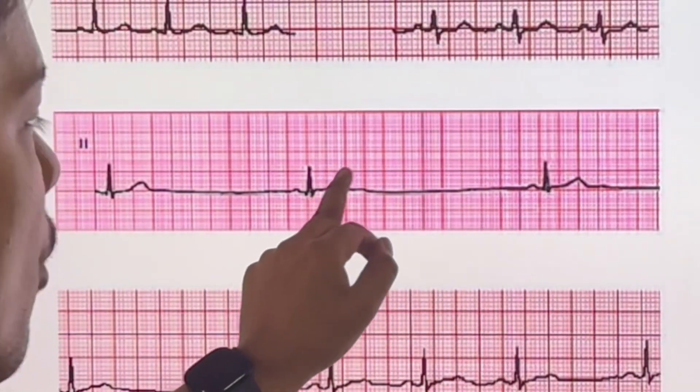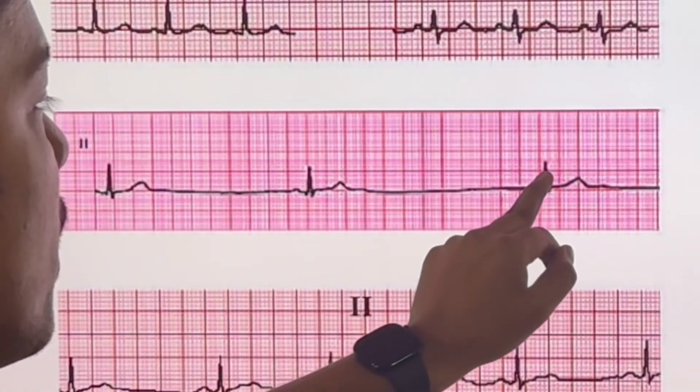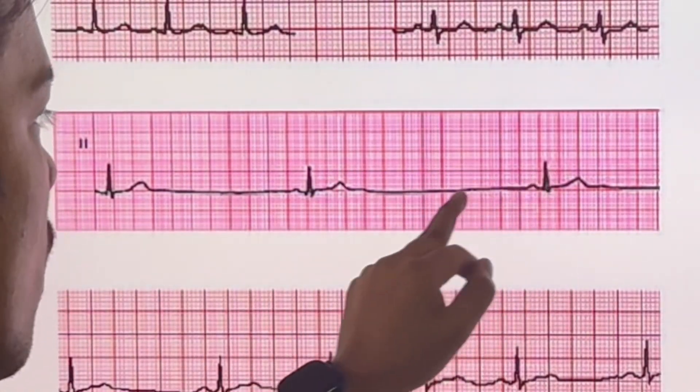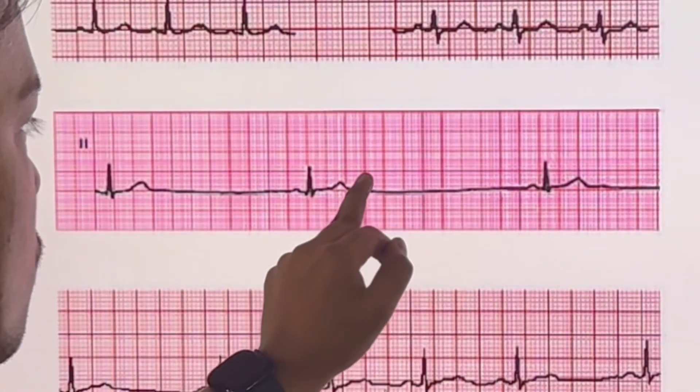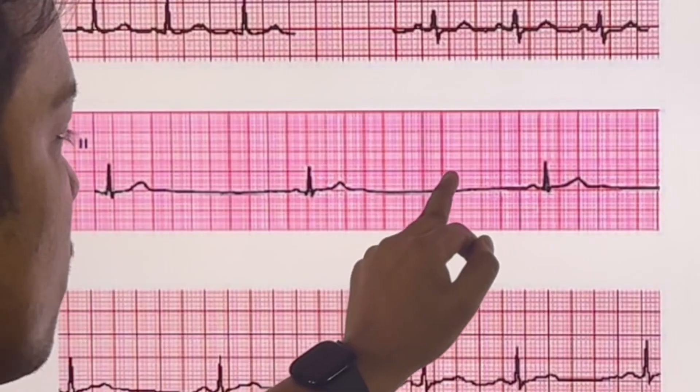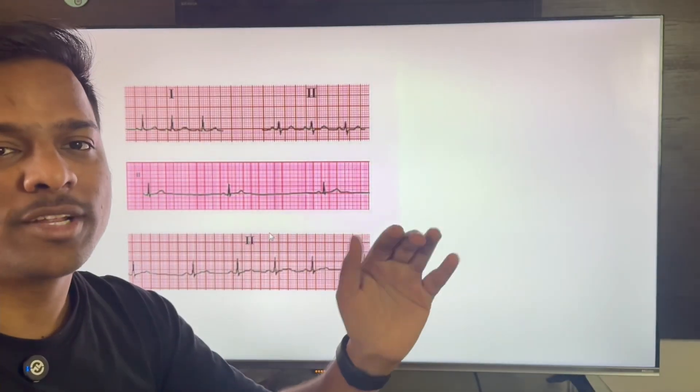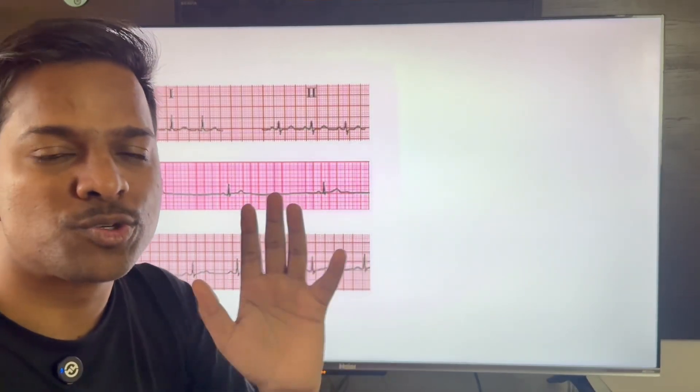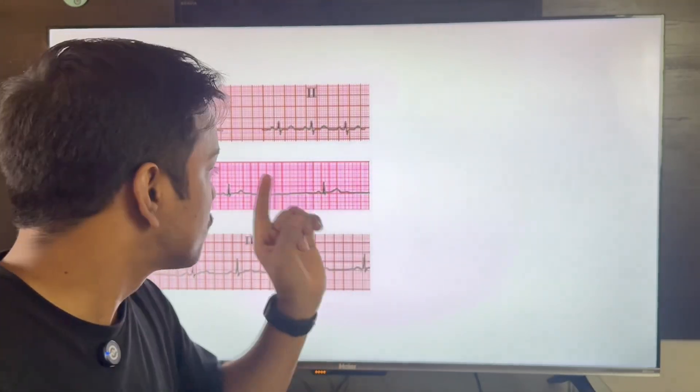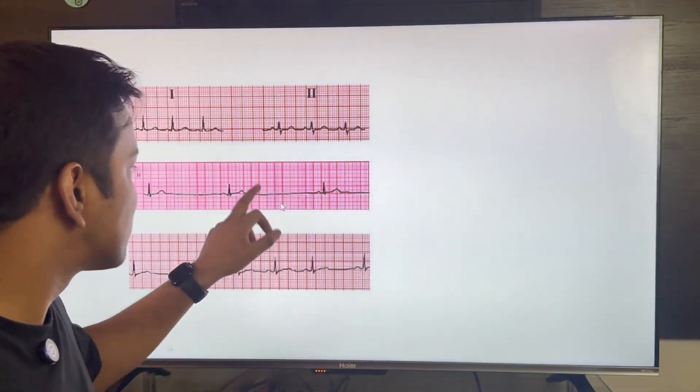In the next ECG, we have P, Q, R, S, and T waves present. The number of big boxes between two RR waves is about ten, so 300 divided by 10 gives a heart rate close to 30. This has to be sinus bradycardia.